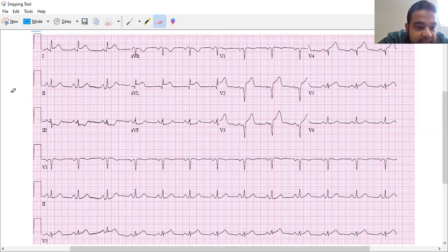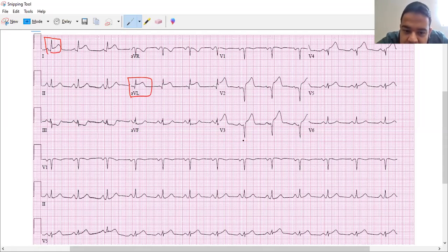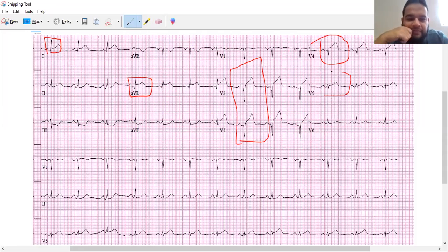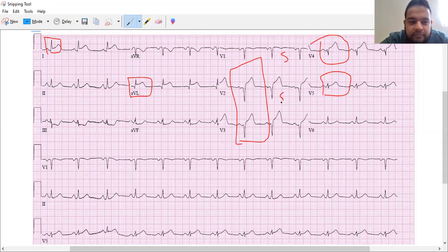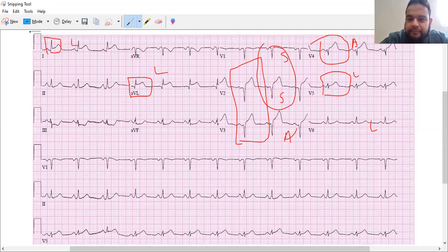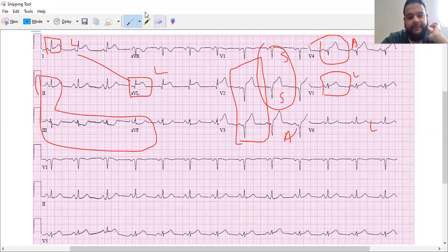I see a little bit of ST elevation in lead one, also in AVL, and V2, V3, V4, and a little bit of V5. So it's mostly like anterolateral leads, mostly high lateral as well. The way I remember this is SAL. So these are the septal ones: V1 and V2; V3 and V4 are the anterior; and then V5 and V6. And then one and AVL are lateral, and then two, three, and AVF for your inferior leads.